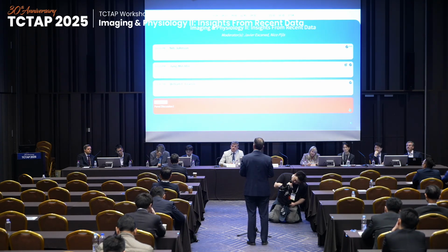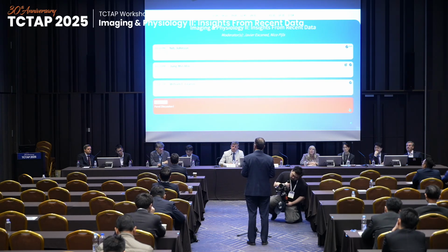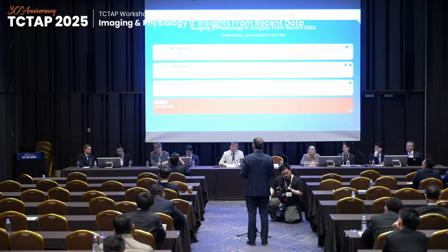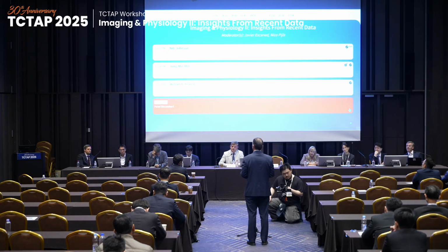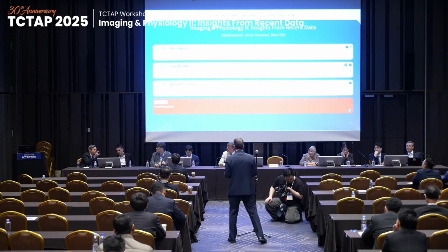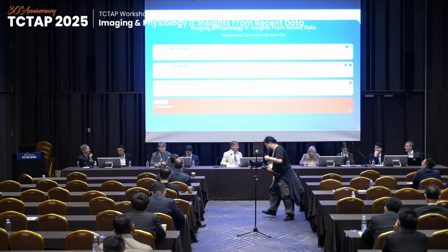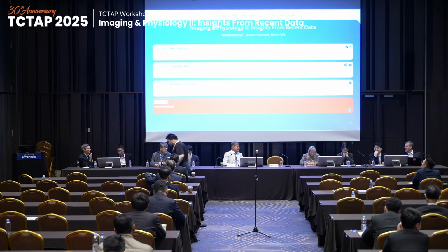But you and Carlos and others showed in the PPG Global study that if you treat diffuse disease, you can have higher procedural event rates and maybe, who knows, worse long-term outcomes. We'll have to see. And since iFR tends to be discordant in patients with diffuse disease, could that be the link or the explanation for why the iFR group had higher mortality? I'll leave it up to others on the panel. Perhaps I don't want to monopolize things. I'll look down the way here to get other people's viewpoints on the interesting hypothesis.